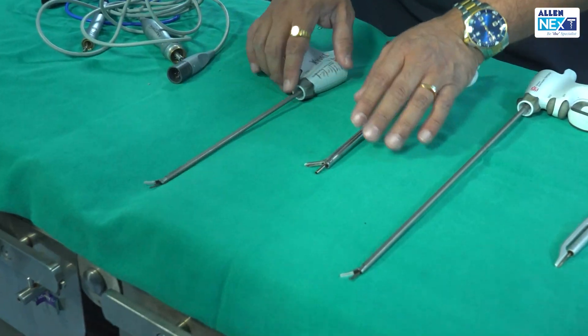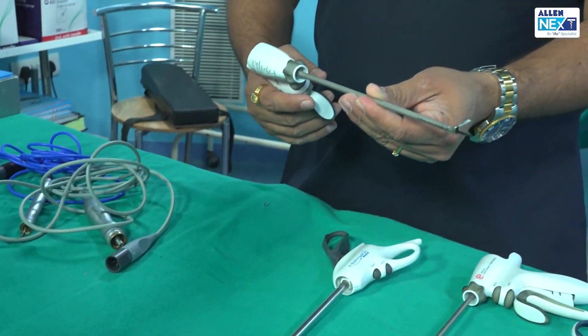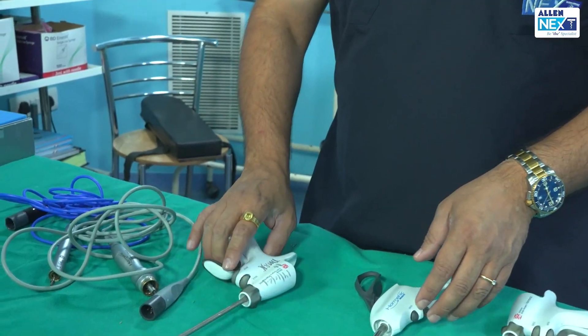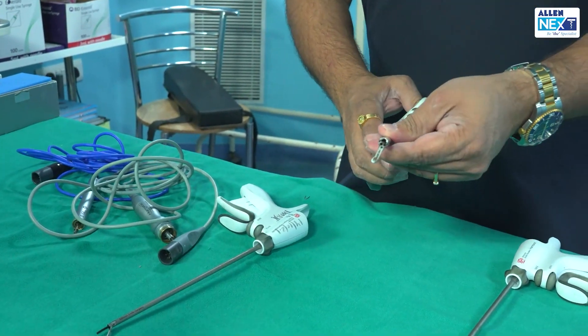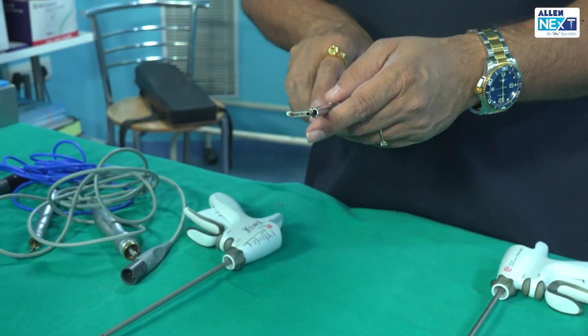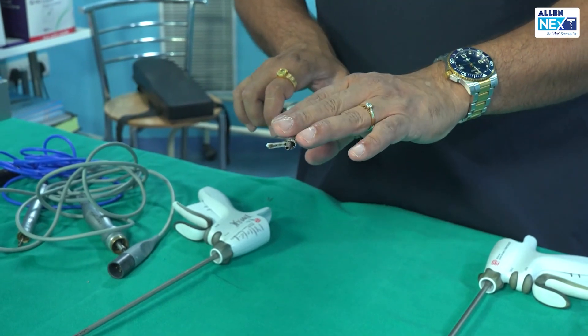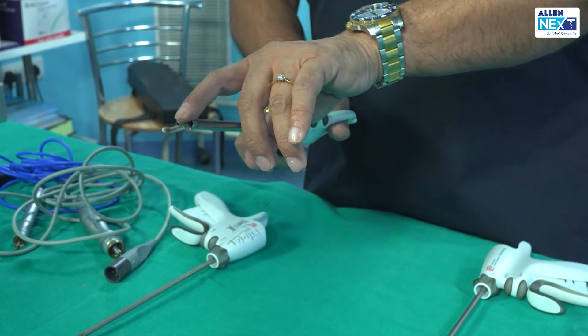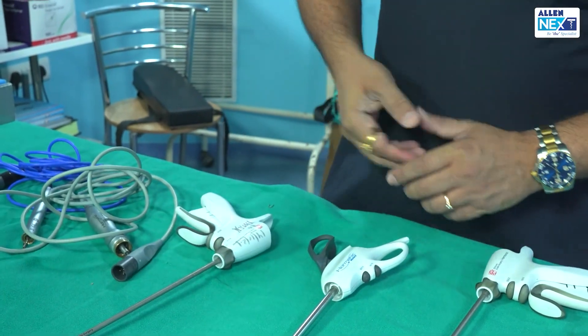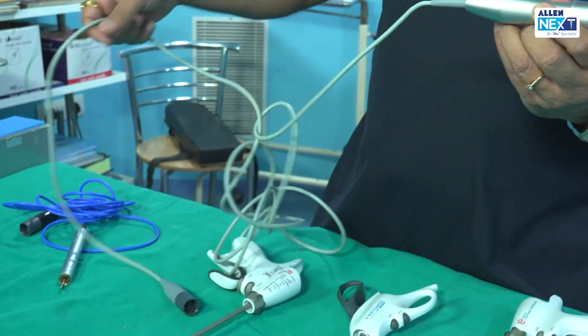We also have a pediatric laparoscopic harmonic — in pediatrics the instruments are not very big. This is the Harmonic Focus, which has the property of cavitation, making it very helpful in liver surgeries. We have the Teflon jaw on this as well.